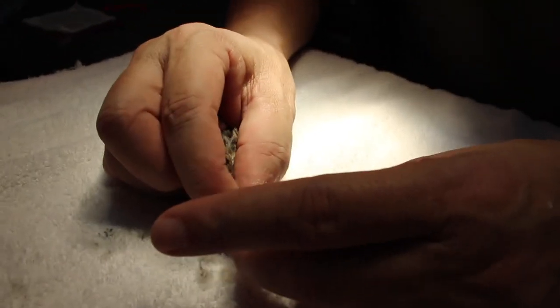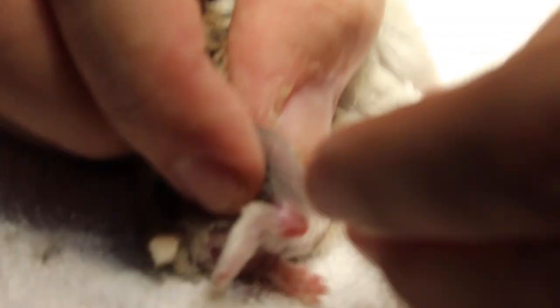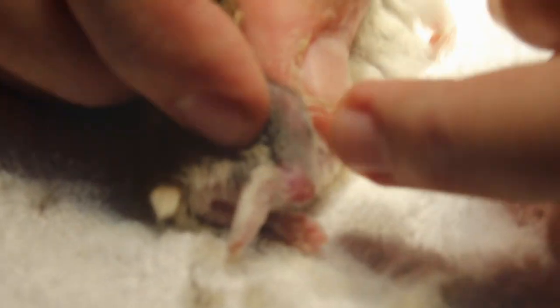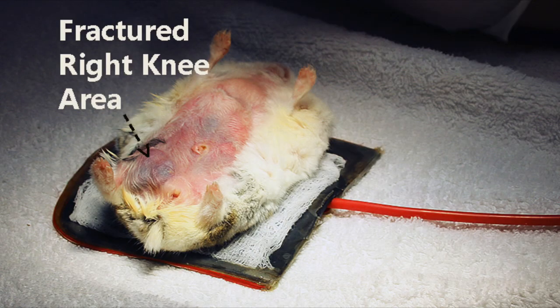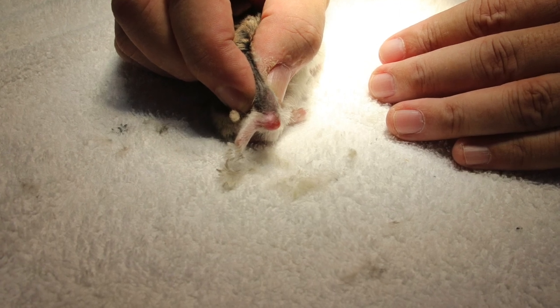After consultation, the hamster was brought into the surgery room for further examination and treatment. Upon close examination, we found that the hamster was suffering from a tibial fracture, which is around the knee area. The fracture was found on its right hind leg, causing it to limp.